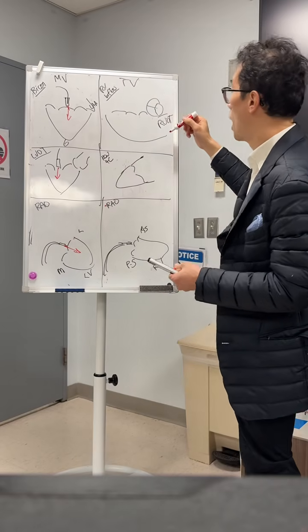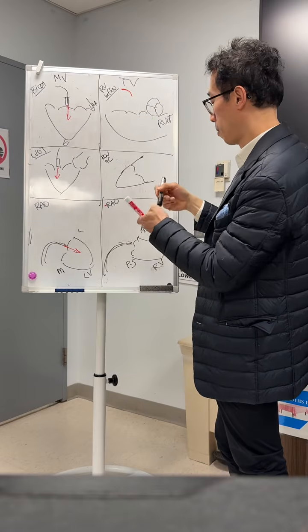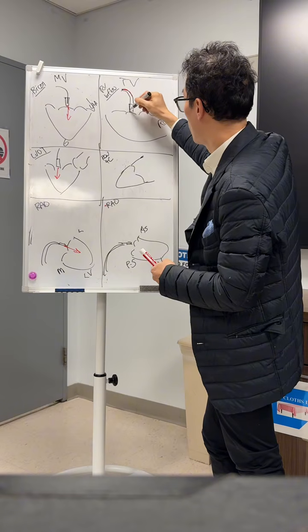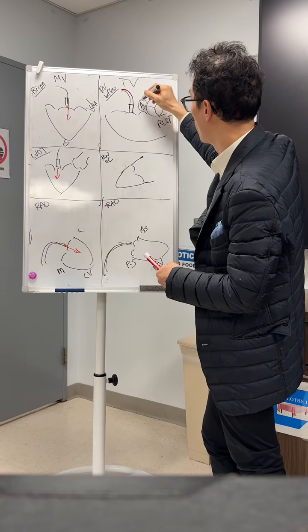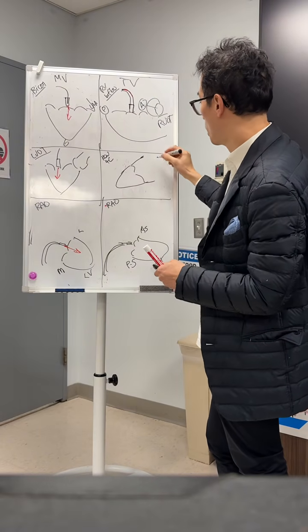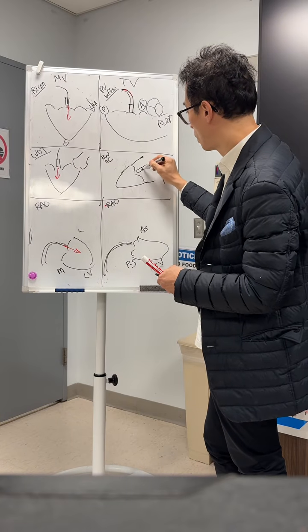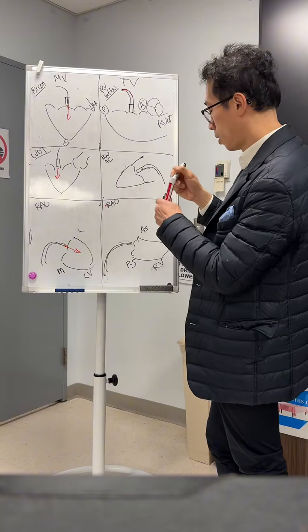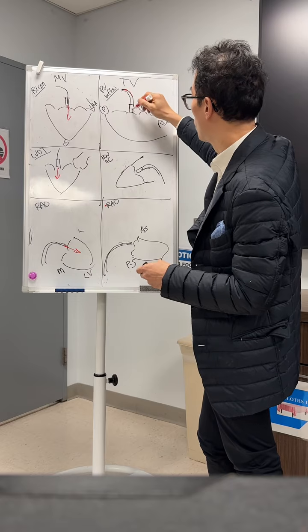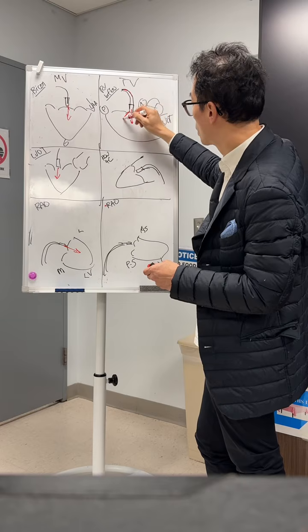Okay, so now with the tricuspid, it's a similar thing. So let's say you're AS, so this is more A, this is more P. Again, you want to be able to, and now this is IVC, so you're now here, the device. You can see now here, you want to go straight. This is an anterior dive. This is a posterior dive.